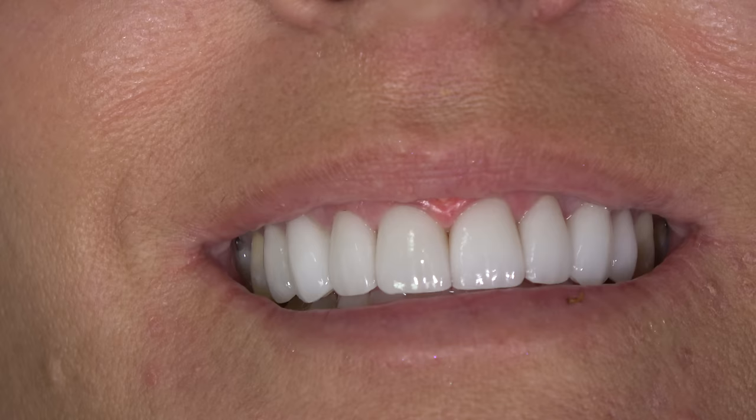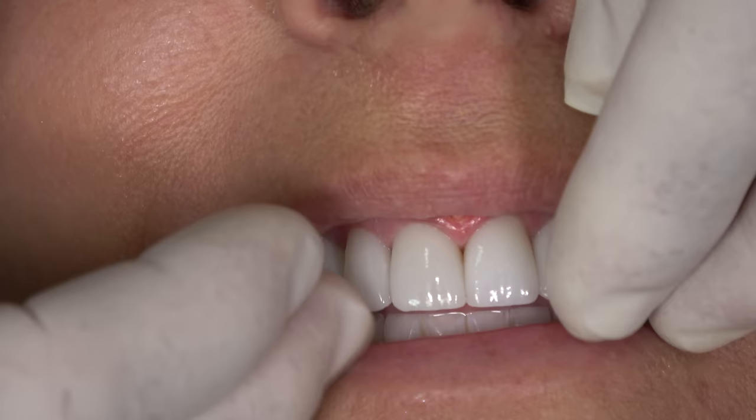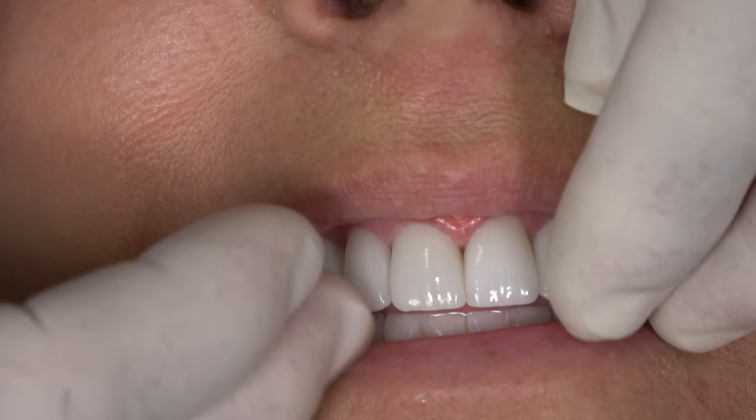You can see how easy it is with the diode laser doing a frenectomy — no bleeding, and very cleanly it removed tissue. That's why we like to use it for fibroma removal, and certainly to trough tissue around crown preps to eliminate packing cord. The more bleeding there is, actually the better it works, because it's attracted to dark pigmentation — the hemoglobin.